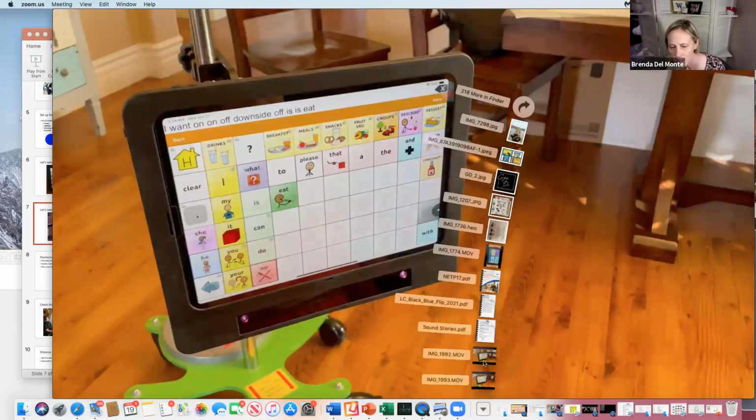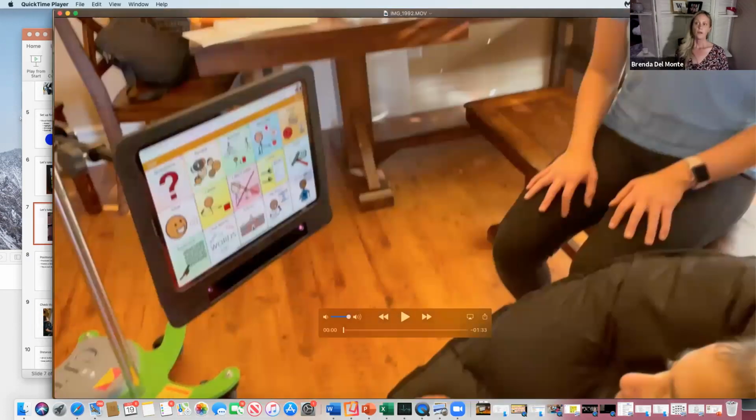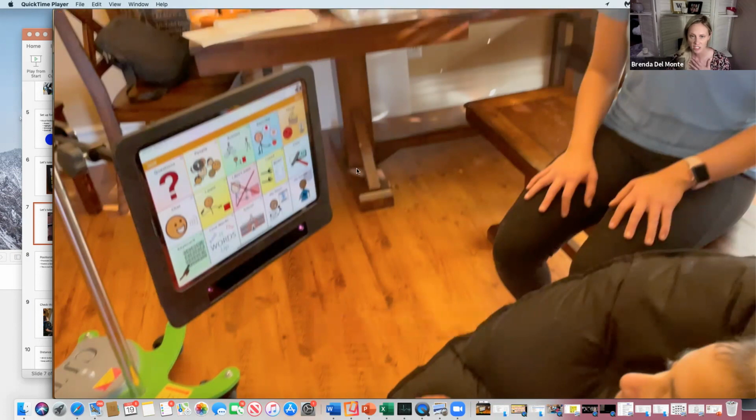So let me just see, it's working through assistive touch, you guys. The good, the bad, and the ugly is there's always the button of assistive touch. I don't know if you can see it right there. So they can always click it and get out. I ended up putting pretty much nothing on assistive touch except for that it would come out. But let me just show you.